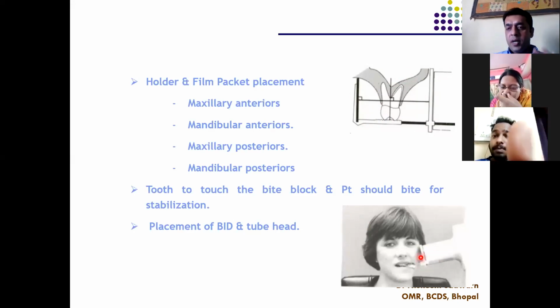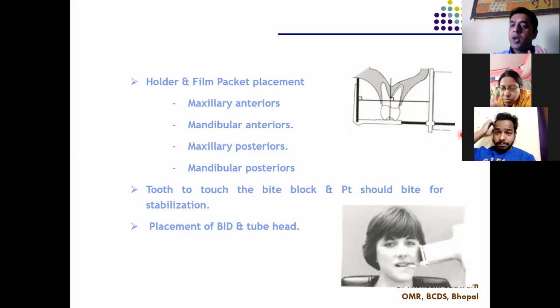The advantage of this technique is that it is very easy to do. Anybody can do it. You just place the film, put it on the teeth, attach the X-ray machine to the ring that is outside, and the radiographs will be taken. We have given a demonstration to some of you. Others, when you come to the department, will be given a demonstration. It will be very easy. So the advantage of this technique is that it is very simple and very easy to use.